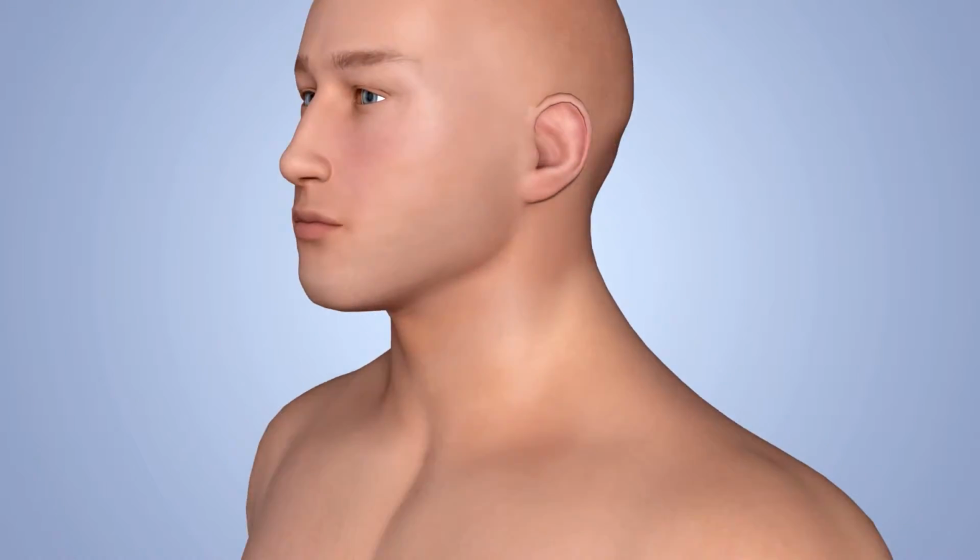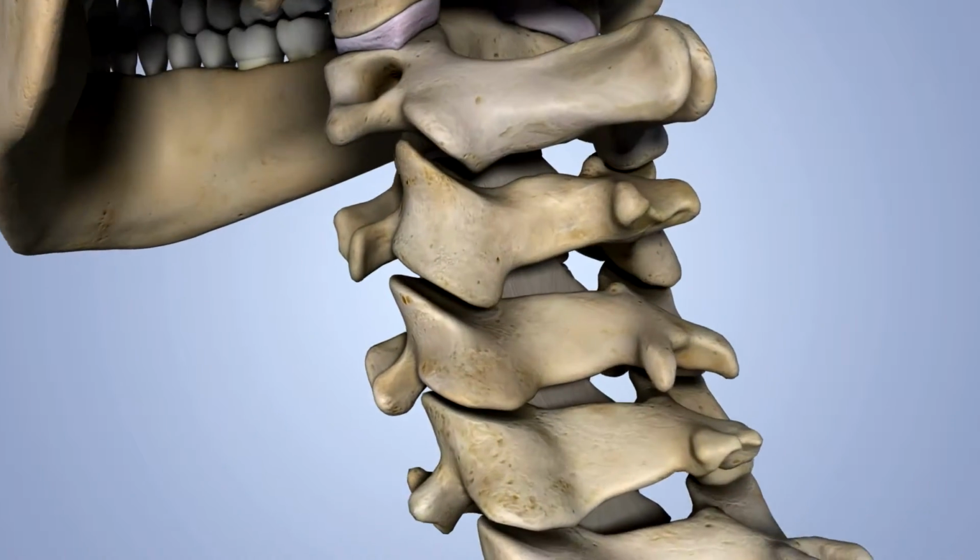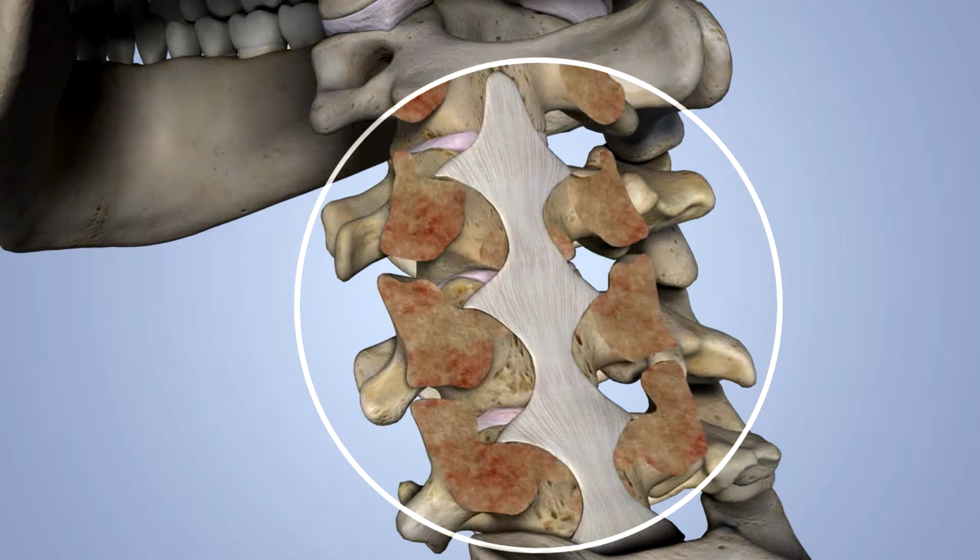So you're actually moving, you're turning, you're twisting, you're bending, and we're looking inside at the spine to see what's happening when you hurt. It helps us to detect what your injuries are, and therefore it helps us to treat you. A motion x-ray is an x-ray that shows the injuries as they occur with movement, and they're showing injuries to what are called ligaments.